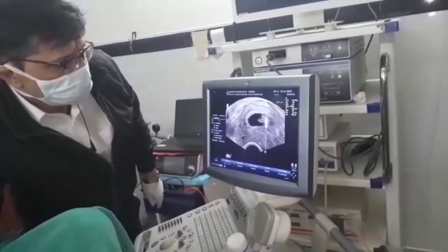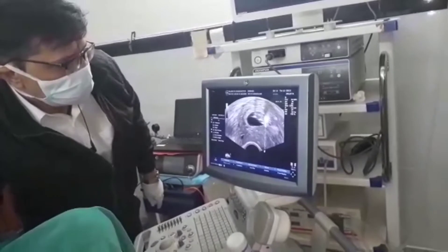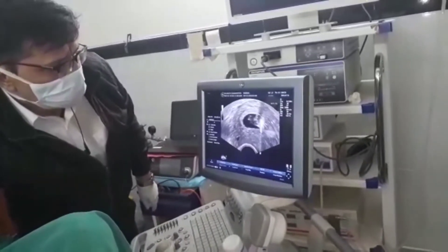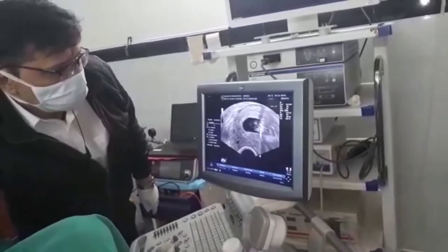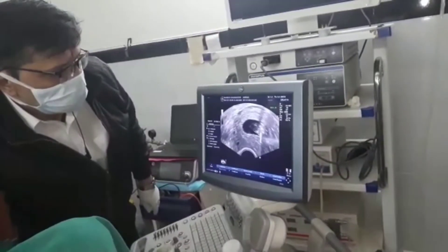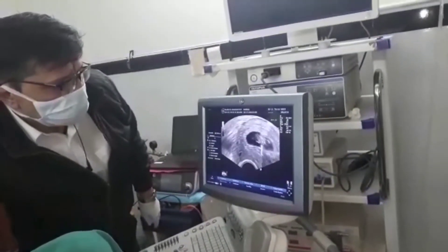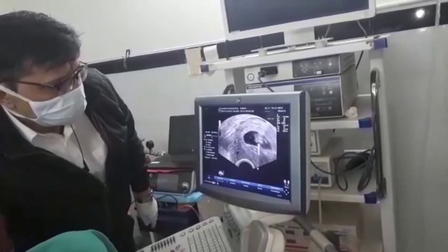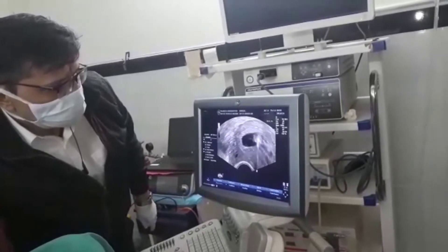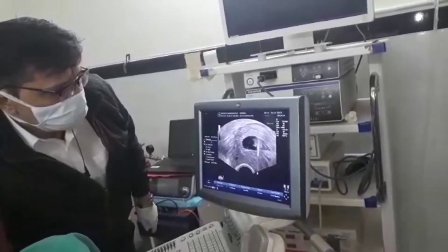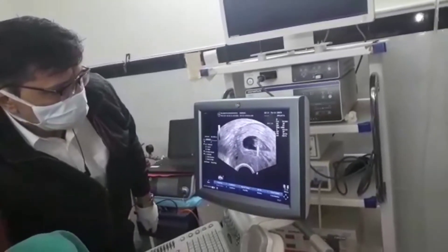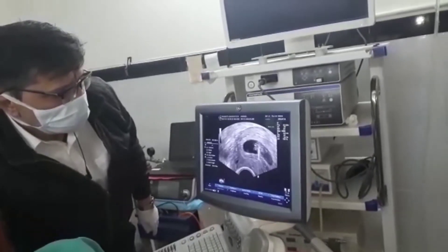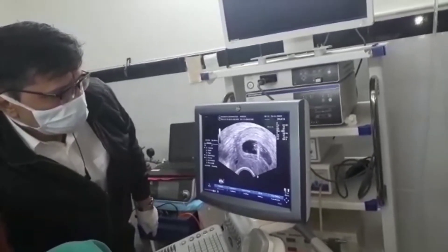We are now instilling KCL with a fetal reduction needle. This is the same procedure we do for fetal reduction in multiple pregnancies of IVF. We are instilling KCL into the thorax of the fetus drop by drop until the heartbeat stops. As we can see, the heart has now stopped.